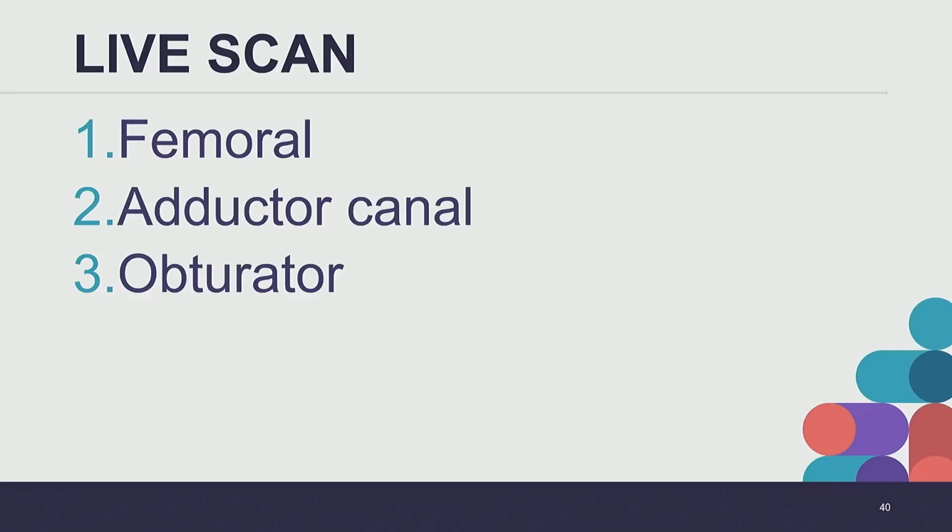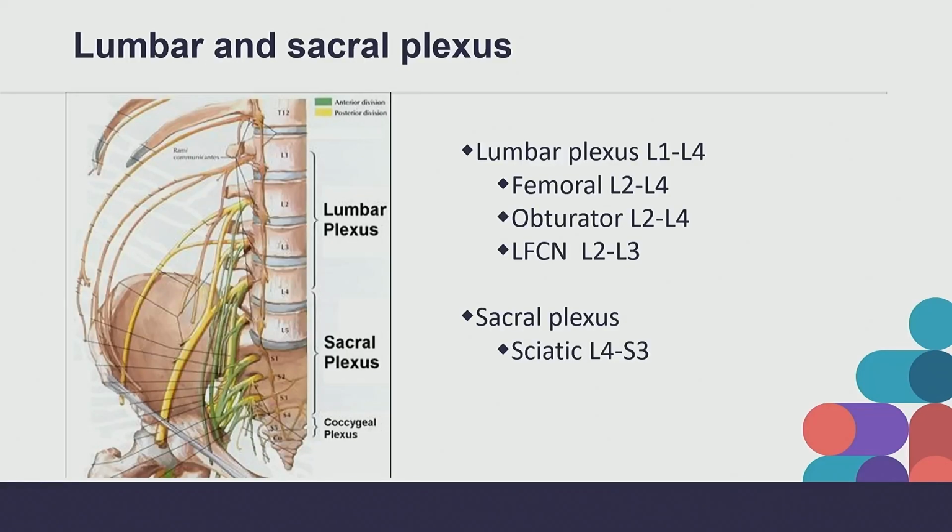All right, for the sake of time, I'm actually going to move forward. If anyone wants to see the obturator at the end, I think it's such a low yield block that for the sake of time, I'm going to skip that. But if you want to come up, I'm not going to offer my obturator, but we'll see if we can scan her afterward.